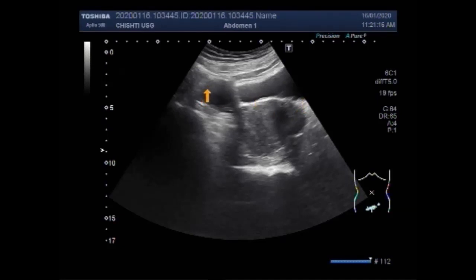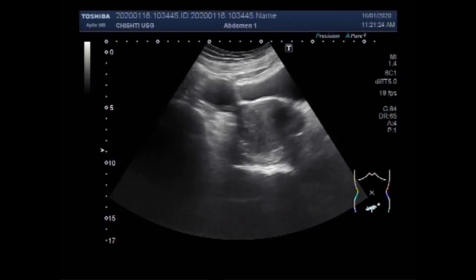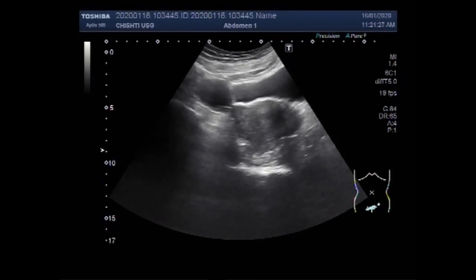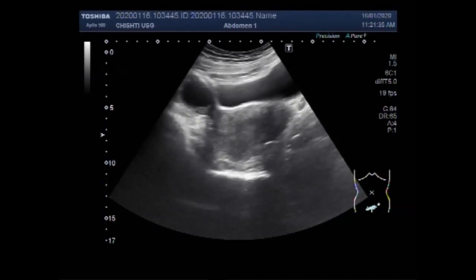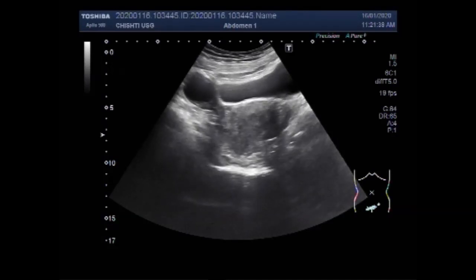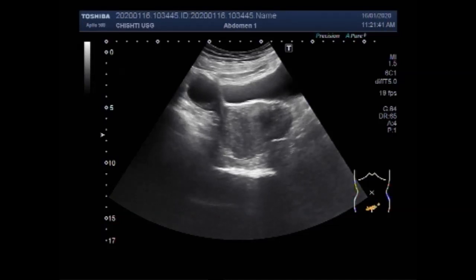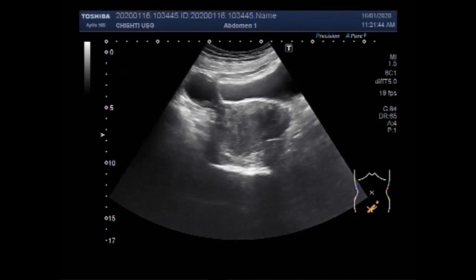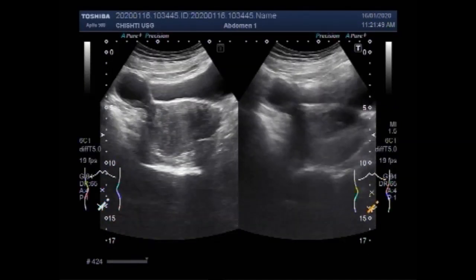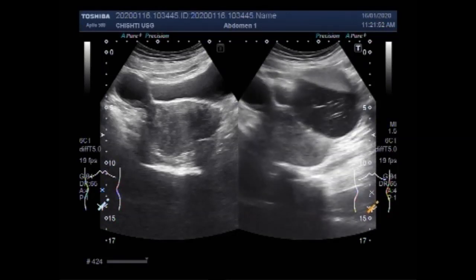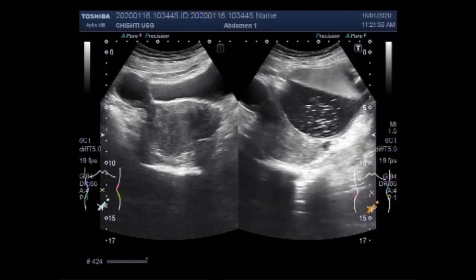This is the left ovarian cyst — it is a small follicular cyst, round to oval in shape, with clear fluid in its interior. You can also see that the uterus is retroverted. Now you can see a large left ovarian cyst having multiple internal echoes.